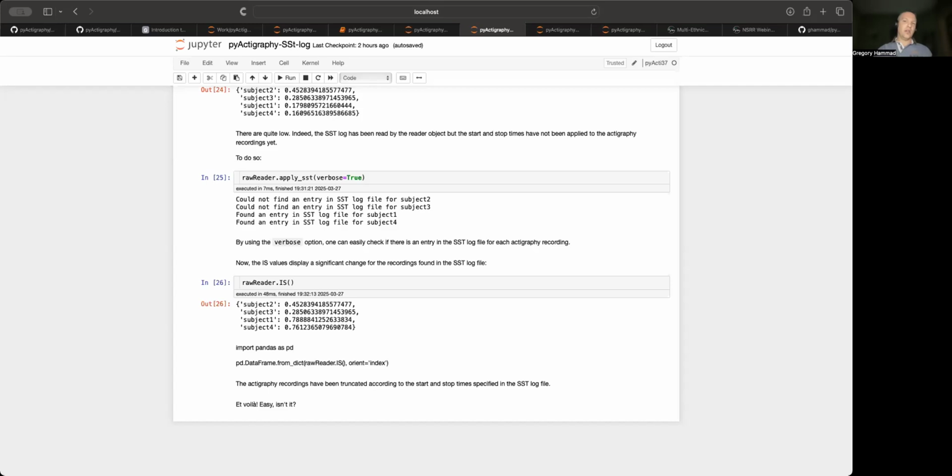What I would suggest is the rest activity detection algorithm, which should just replace what you would do, but in an automatic fashion. If you are just interested in detecting rest periods, irrespective of the fact that behind the scenes it is sleep, because the rest activity pattern in itself is useful or important to study.